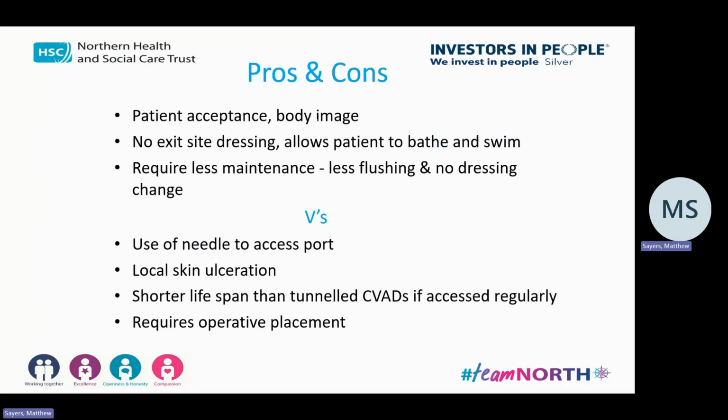The pros are the patient's acceptance of it and their body image, especially for older children. There's no exit site dressing, so that allows really important things like bathing and swimming for kids, so their behaviour can be normalised a little bit more. And there's less flushing and no dressing change, so there's less maintenance.